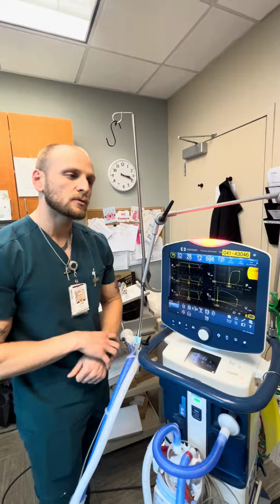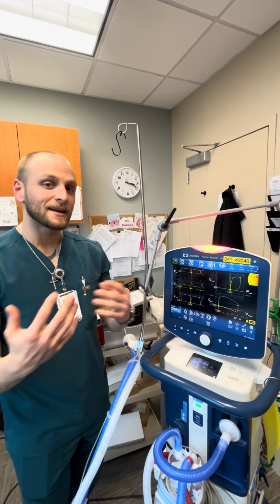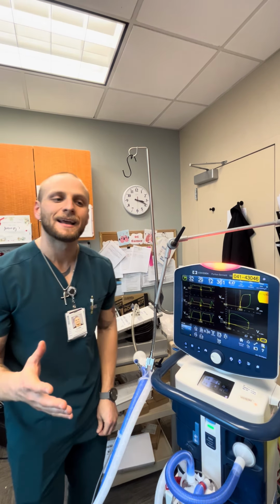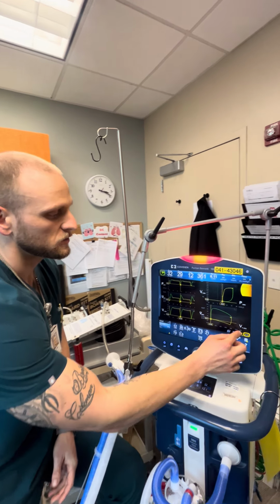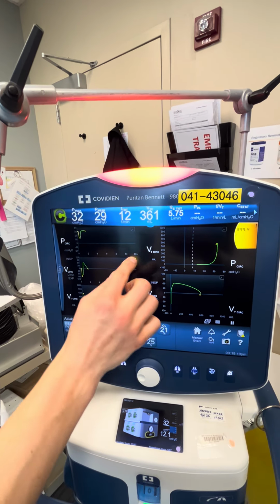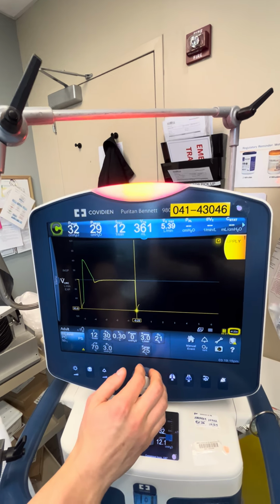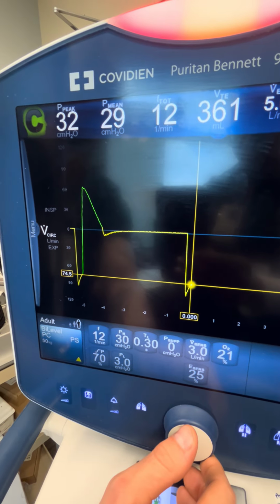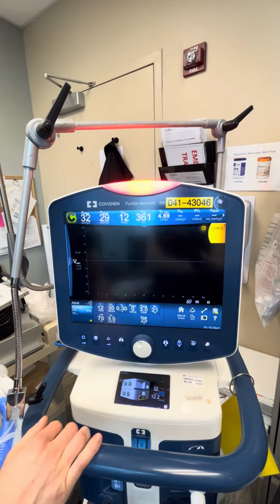In most cases, I don't think the physicians will want you to go under 0.4. So if you get to that point and you're not quite at that 75% mark, that's okay. It is a window and every patient's different, right? Get it to close to that 75% as you can for your patient, okay? So just to do this, I made it 0.3, which you'll never go this low, but just for the sake of the experiment here, we'll pause it again. Now we're at 90, 95 about, right? And then now we're right at that 74, 75. So for this patient and this patient's lungs particularly, this is exactly where we want to be, right?